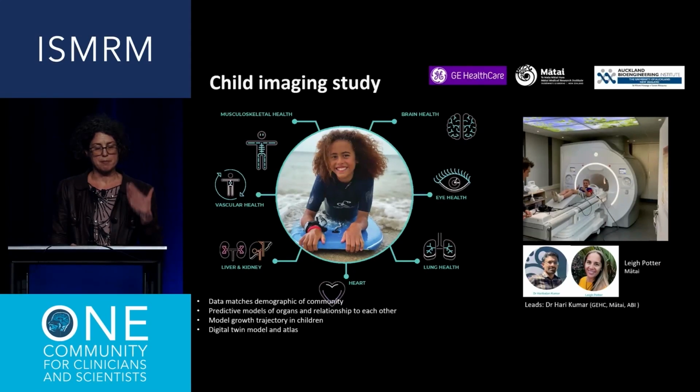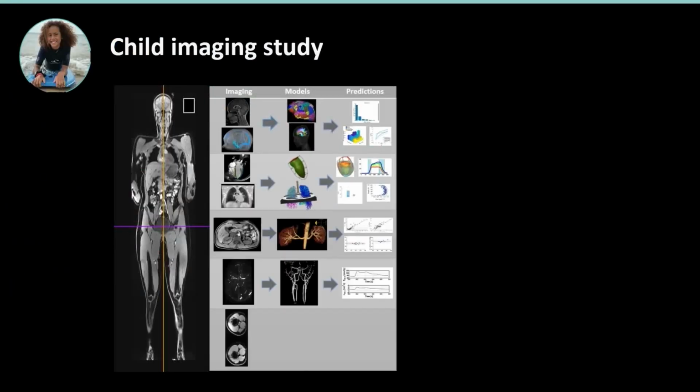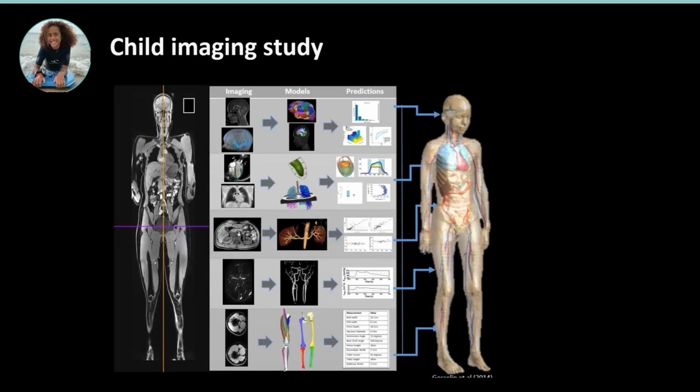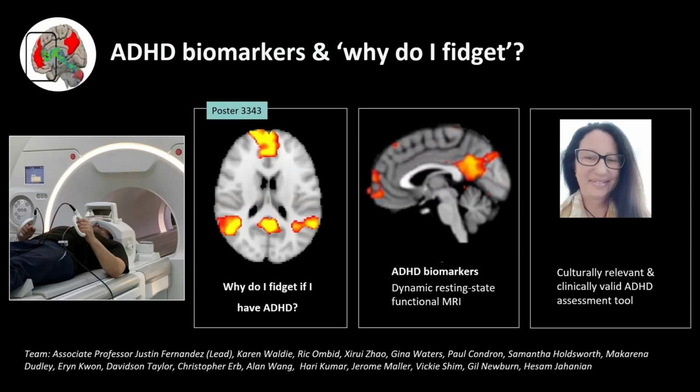And so we're taking images from head to toe, brain, heart, musculoskeletal system, vascular, and really leverage our collaborators at the Auckland Bioengineering Institute's world-class computational modelling methods. And here's an example of the output from our first pilot study, where we've taken the images from each of the different body parts, and we've created computational models, the Auckland Bioengineering Institute teams have, and then they've made predictions about the variability in structure, function, and physiology. So for those interested to know more, here's the article that just came out, and the next steps will be expanding this project into a larger cohort and scanning kids over a longer time frame.